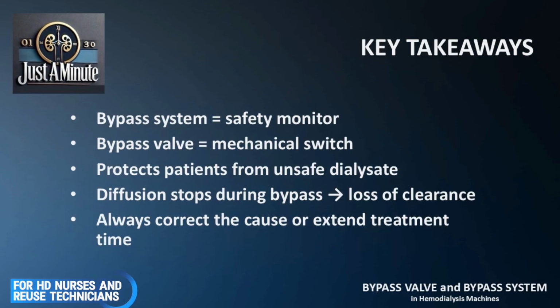To summarize, the bypass system is the safety monitor and the bypass valve is the mechanical switch that enforces protection. While this keeps patients safe, dialysis stops while bypass is active. It's essential to fix the problem quickly or extend the treatment to ensure adequate dialysis delivery.